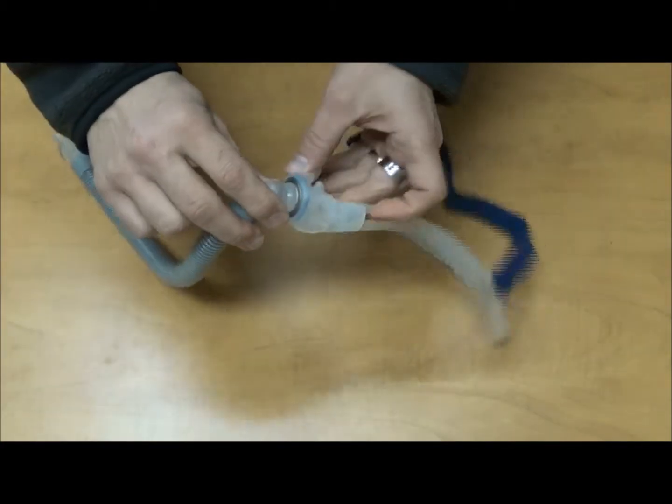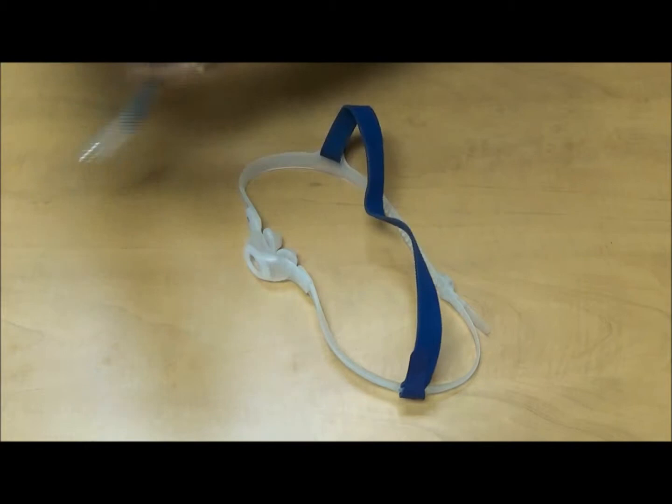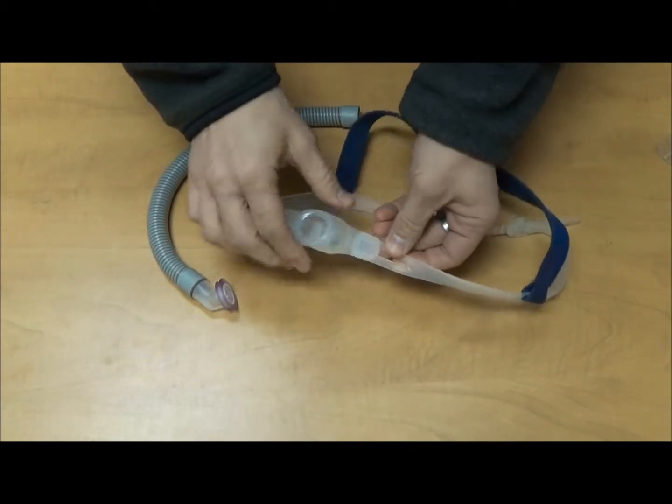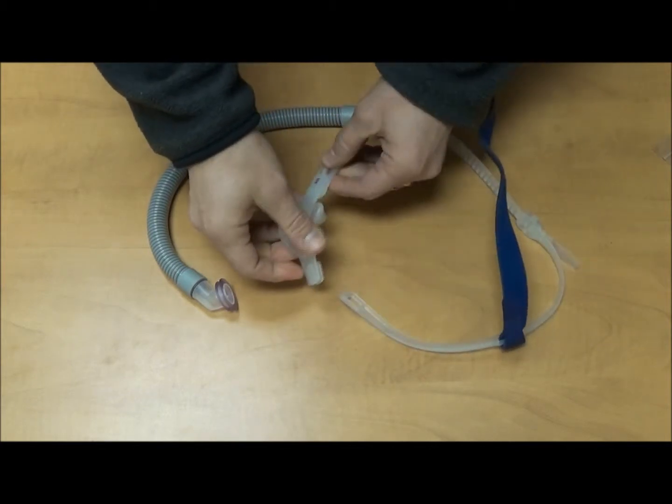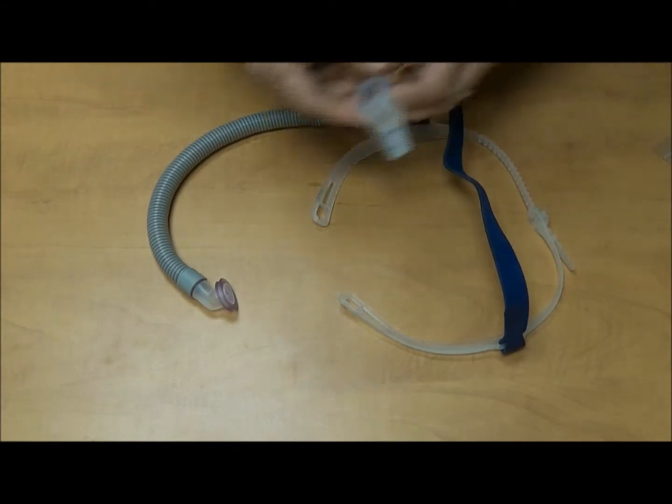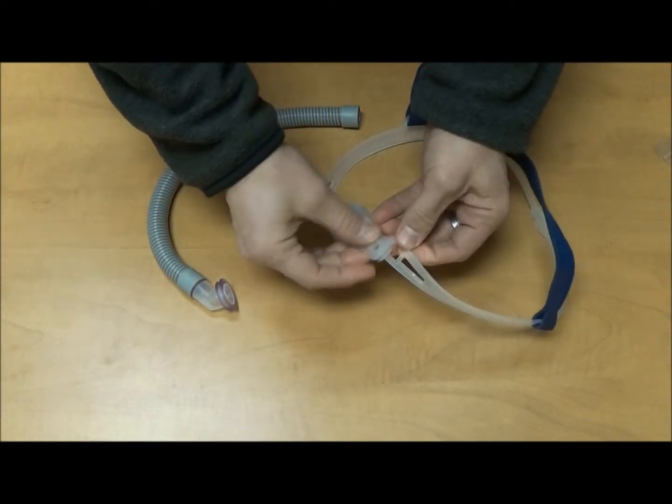First step, we're going to take this front tubing assembly right out of there. Although the Swift FX for her comes with a medium, we're going to make this extra special and put on the small size, which is specific to the Swift FX for her package.